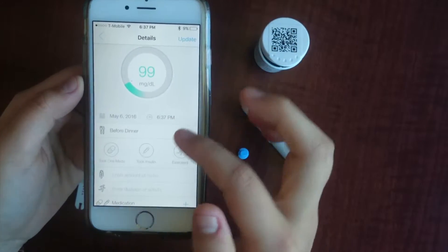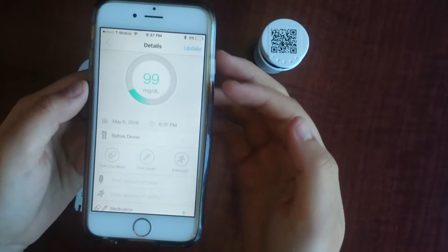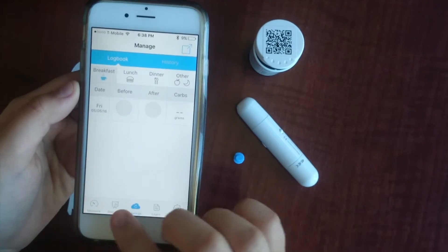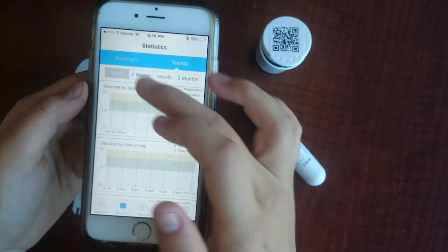You can see here on the app it displays the glucose levels in milligrams per deciliter. You can then go back to previous readings and see what the trends are. This is how you use the iGluco application.